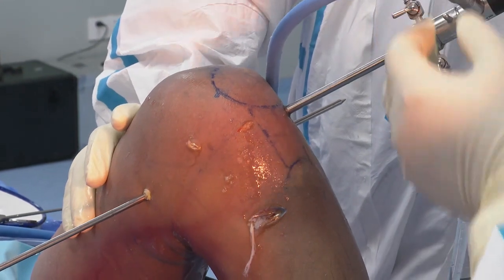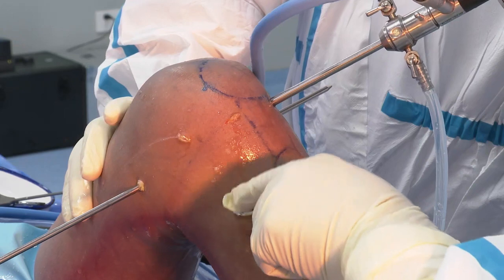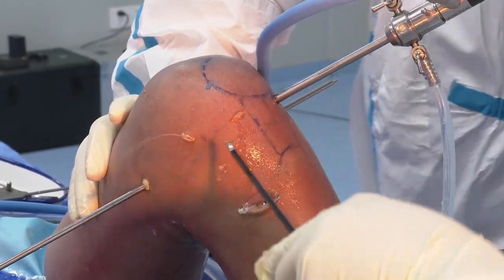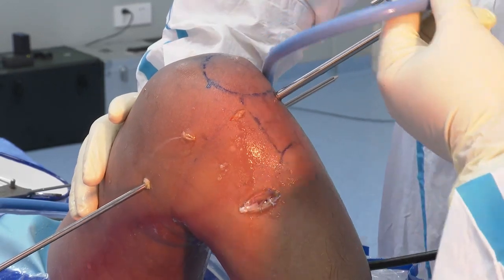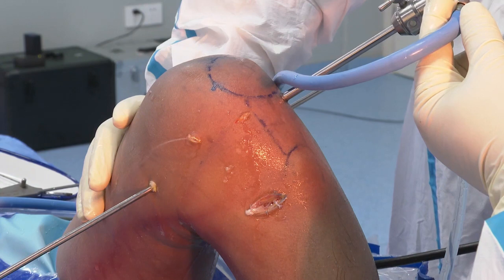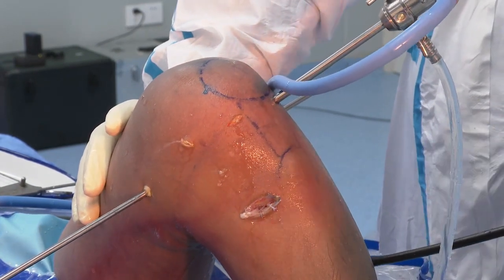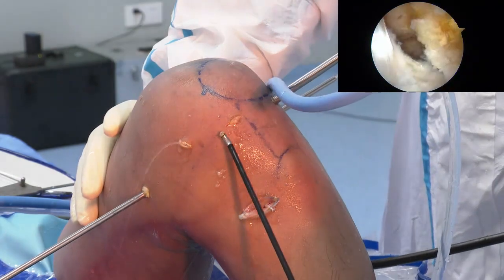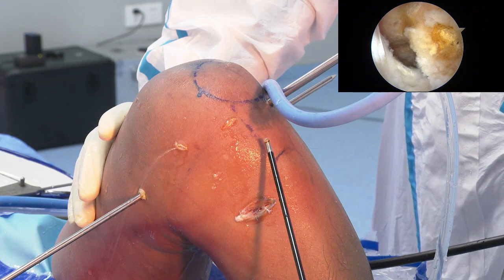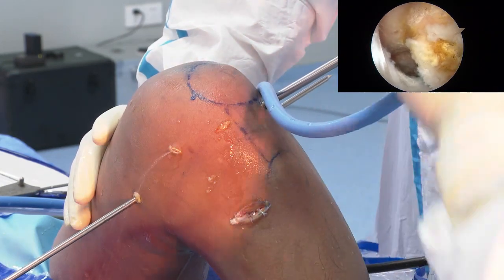Okay, good. We will show you later about the techniques. 那具体我们一会儿放进去的时候再介绍这些操作关系。 So nowadays, I think we prefer to do the ACL reconstruction using the transportal technique. 那 ACL 重建呢，现在主流是经通道制作隧道。Right. In the past, we did the transtibial, but we know that if you're doing the transtibial, you cannot meet this point from the tibial side. You cannot go to the anatomic point. It always goes vertical, right?